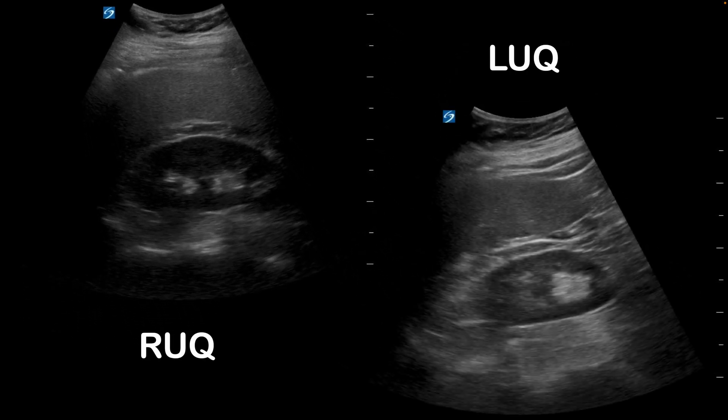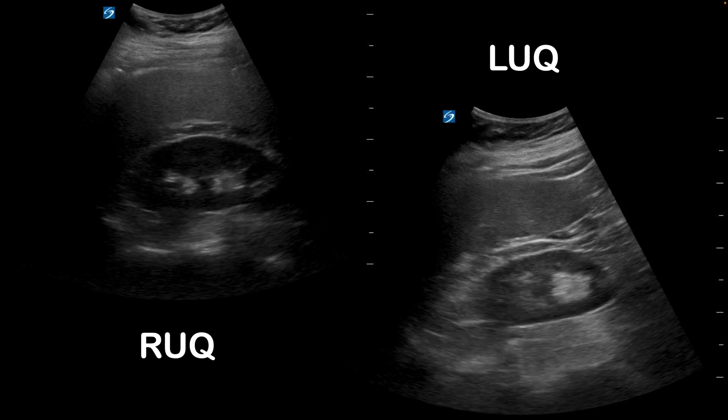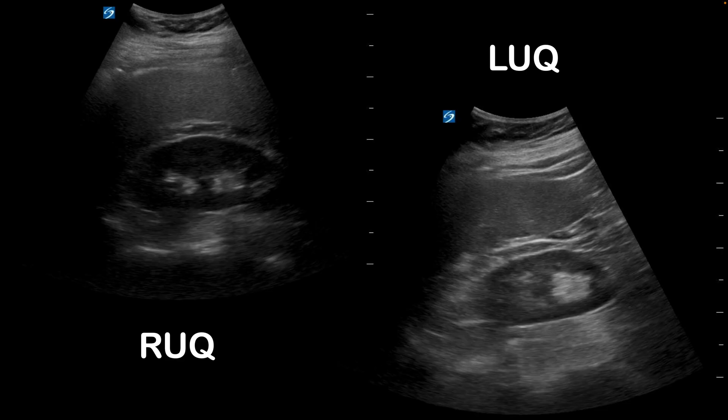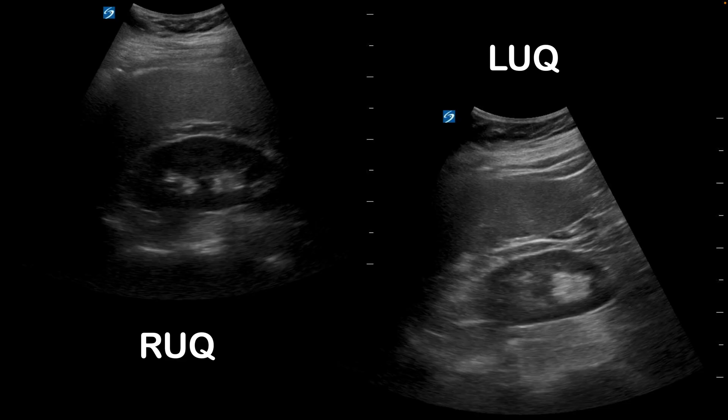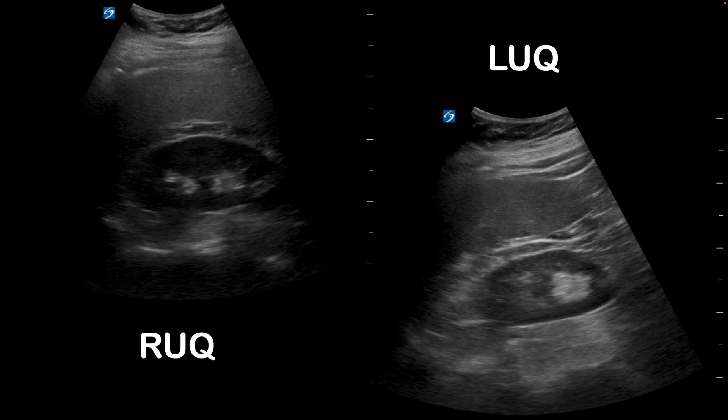This is the same patient. One other thing to pay attention to is that typically they'll have the same finding on both sides. In the right upper quadrant we see the liver and the kidney, and on the right side of the screen we see the left upper quadrant — the spleen and the kidney. We see that on both sides there is a double line sign separating those areas. Not always, but you'll typically see that on both sides if somebody has it. They can have free fluid on both sides too, but you're looking for those double hyperechoic lines — that's your double line sign.